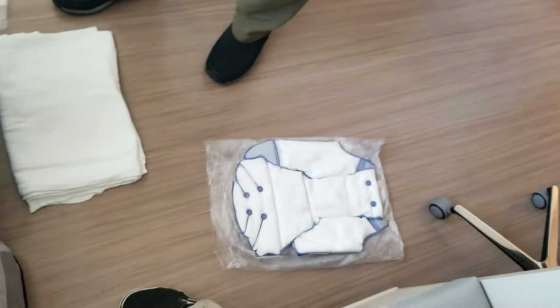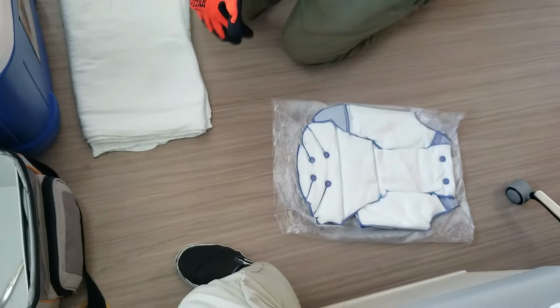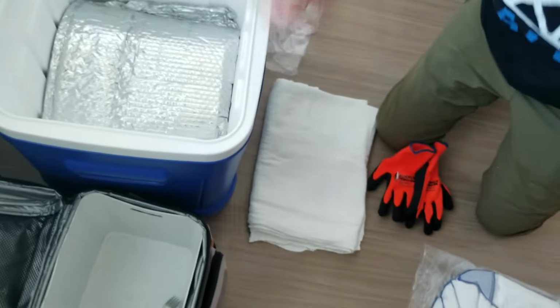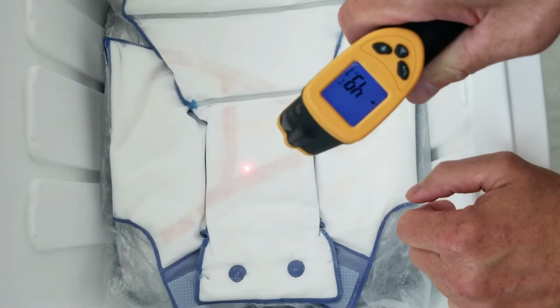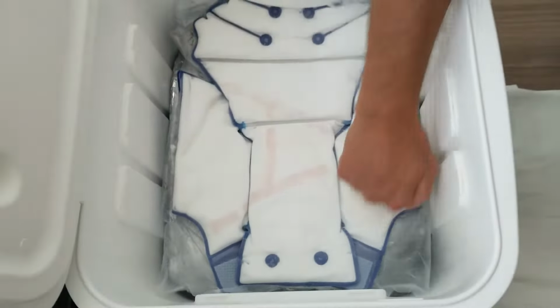And then we're gonna actually, oh, sorry about that. Oh, this is the one that's going on next. Don't need my gloves on for that, but that's just gonna sit on the top. Right now, this is my thermometer, probably wouldn't even read this. This goes to -50, and it's at -50 right now. It's off the chart. And it's almost as hard as a rock. And that's where you want it to be.